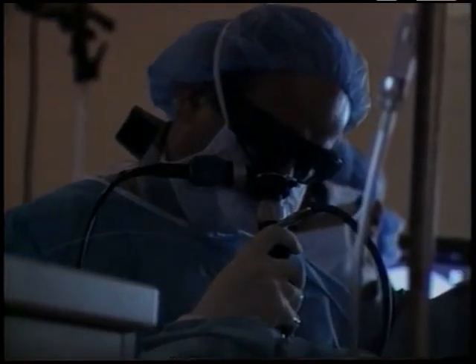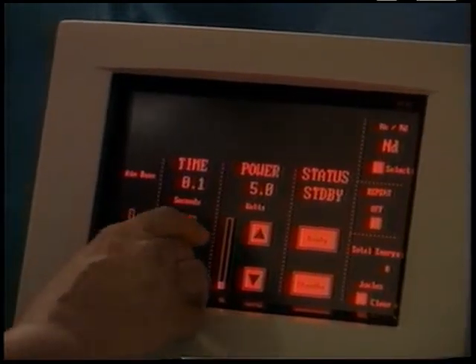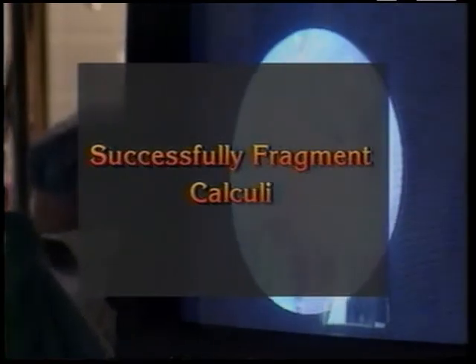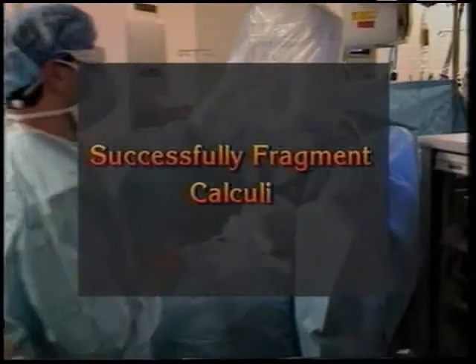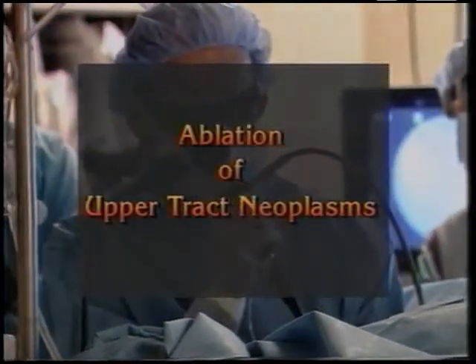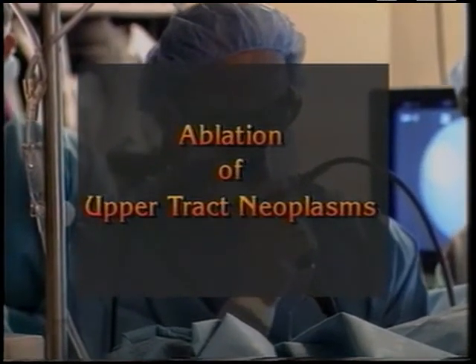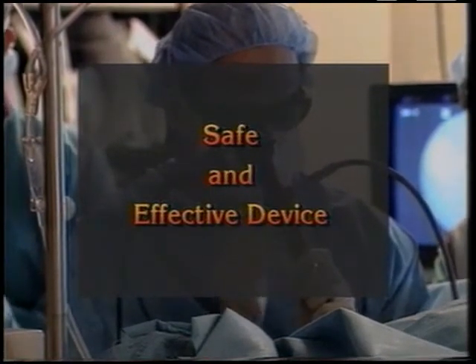In this series, we have demonstrated several techniques and advantages of the Holmium laser in the upper urinary tract. It can successfully fragment calculi throughout the urinary tract. It can even successfully fragment stones such as cystine, which are more resistant to shockwave lithotripsy. It also can be used for the very accurate and controlled ablation of upper tract neoplasms and the incision of ureteral narrowings. It is a safe and effective device for many applications in the upper urinary tract.